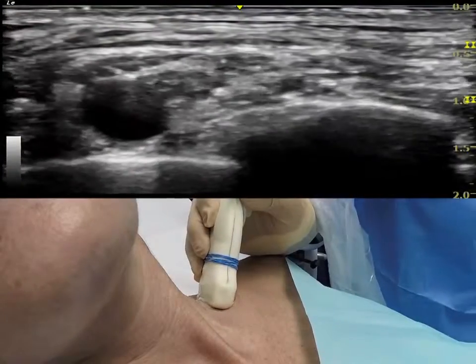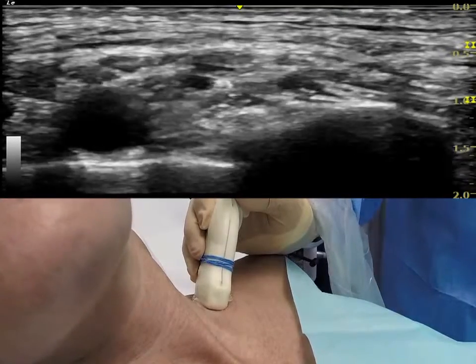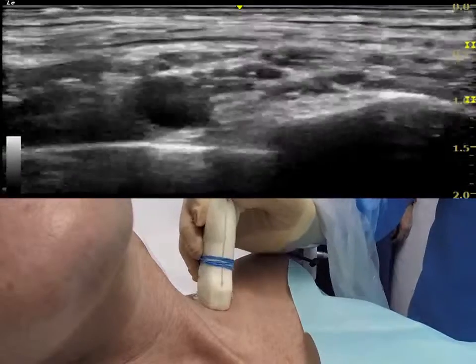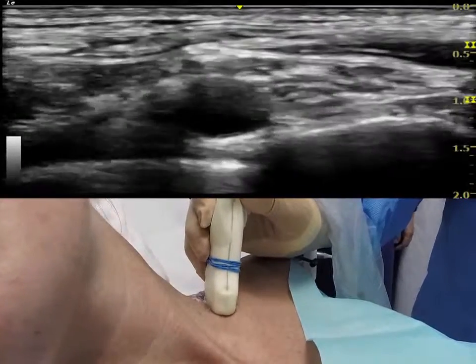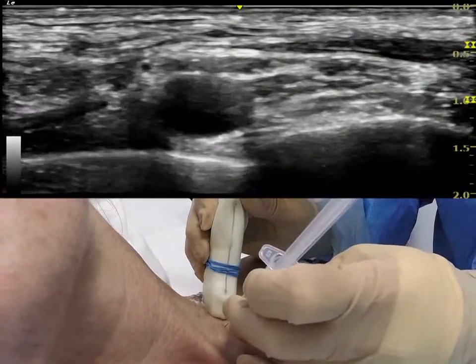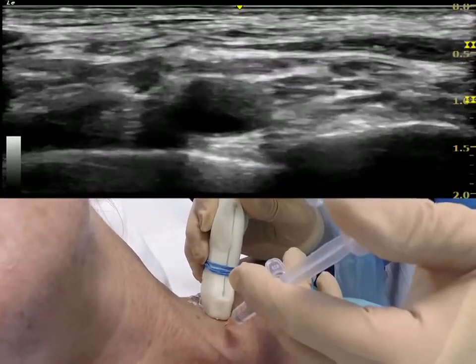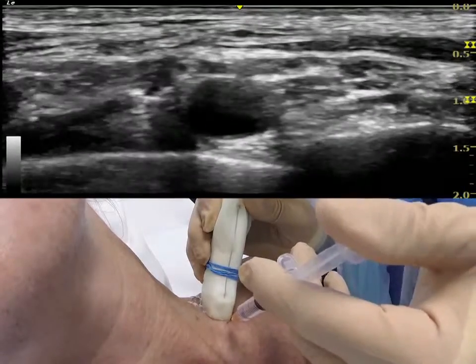This video shows the insertion of a supraclavicular brachial plexus catheter using the Pajunk e-cath system. For a single shot nerve block, we use the lateral to medial approach that you're probably familiar with, but for a catheter we use a medial to lateral insertion as demonstrated here.